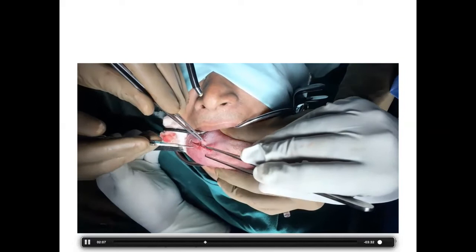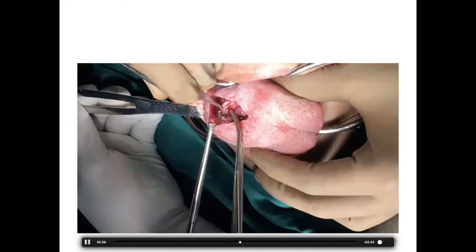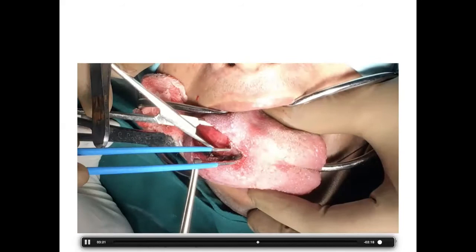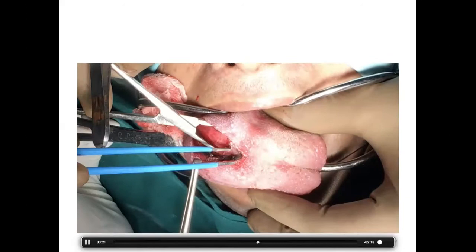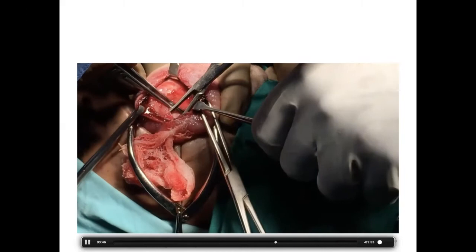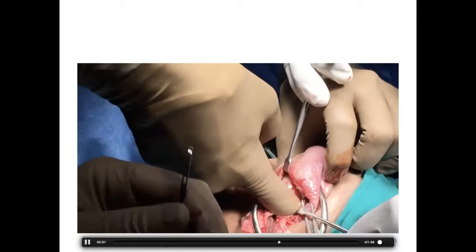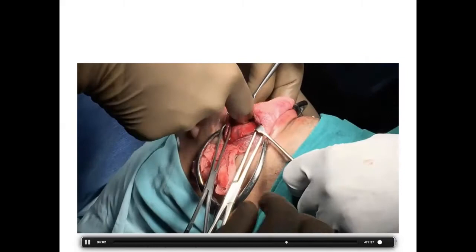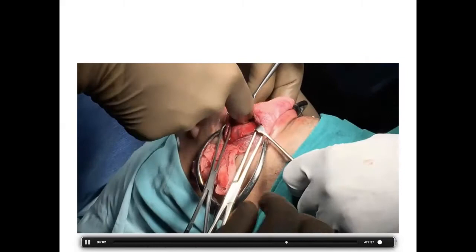We alternatively used monopolar and coblator, then at the capsule used bipolar or coblator — bipolar for big vessels, coblator for medium-sized vessels. We meticulously created a plane, including finger dissection to palpate the lingual artery. Once confirmed the lingual artery was medial to the swelling, we proceeded with further dissection.